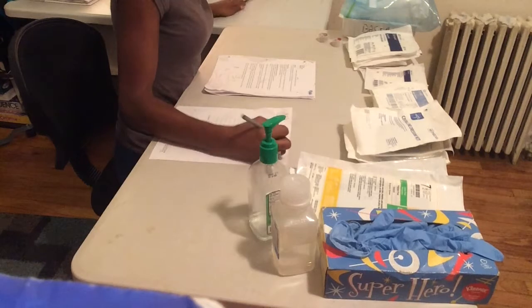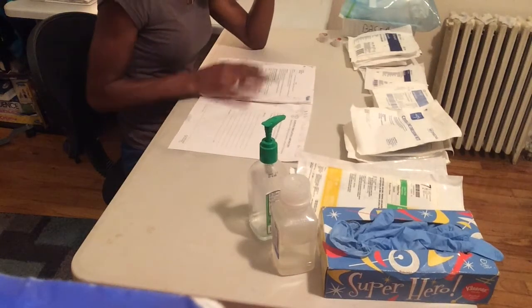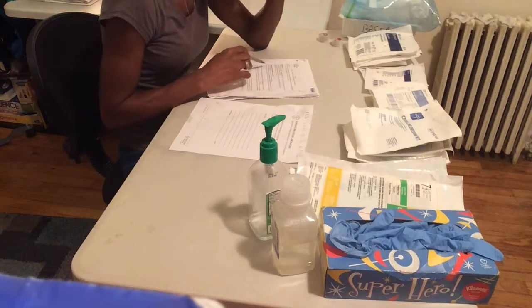What you see me doing here is writing my mnemonic along the top that will help keep me on target throughout my sterile technique station. Now I'm reading the SBAR for any pertinent data that can help lead me to my clinical decision for what procedure I will be performing.